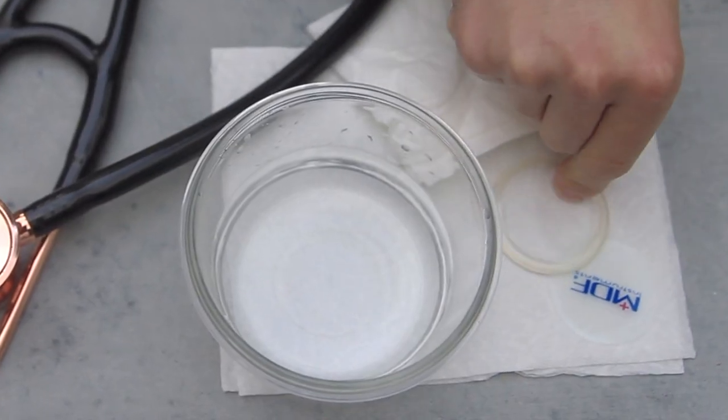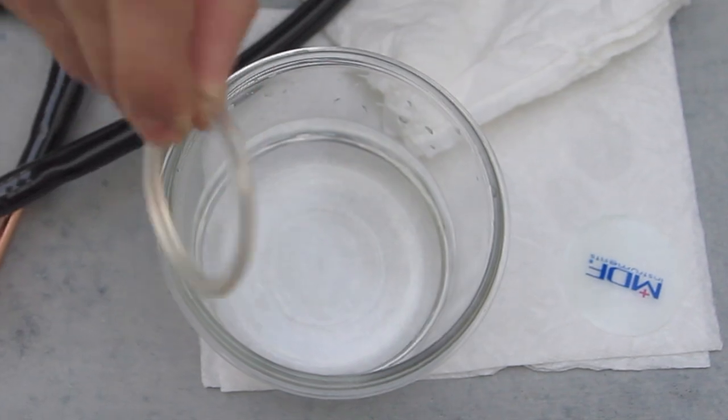To place a diaphragm into your retaining ring, warm up the ring to make it more flexible. You can warm up the retaining ring in warm water or in a cup with a blow dryer.